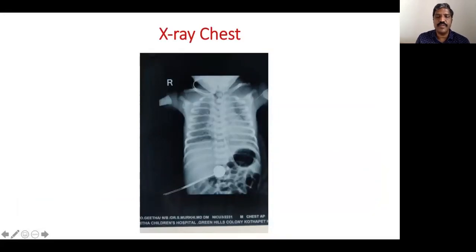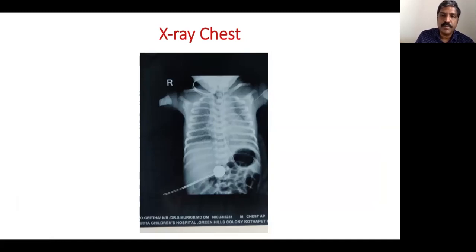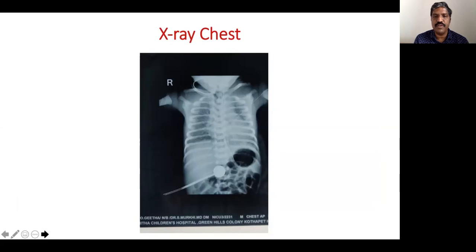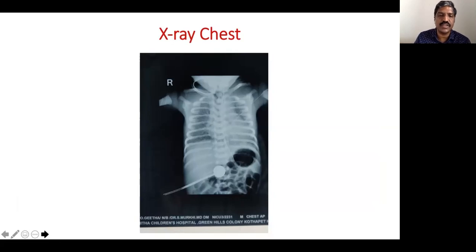The admission X-ray shows a very clear reticulogranular pattern in both lungs with reduced lung volume of about six and a half spaces and air bronchograms extending into the retrocardiac shadow. This confirms RDS — respiratory distress syndrome, historically called HMD. In a preterm baby less than 35 weeks with respiratory distress starting at birth, progressing, and with this X-ray appearance, it is almost certainly RDS.